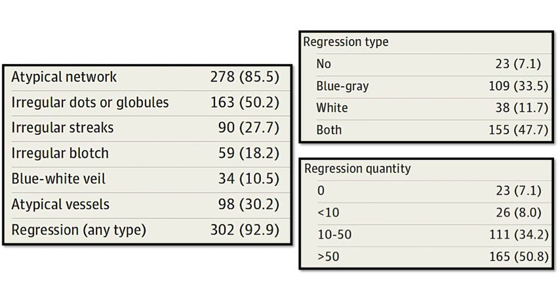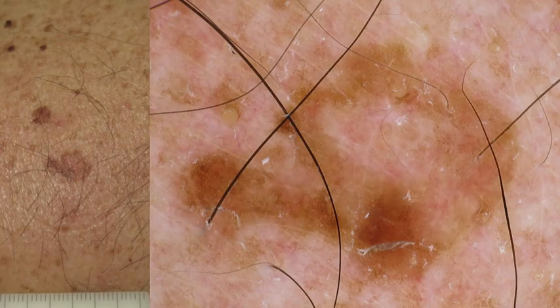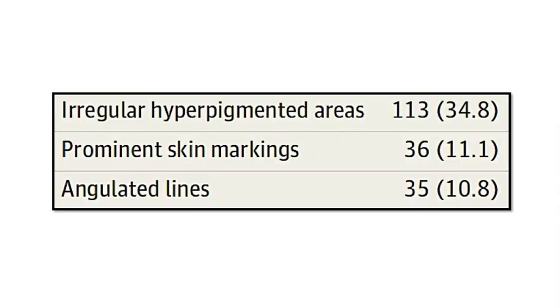Speaking about frequencies of criteria, the classic features that we knew for years were present in some melanomas in situ, but as you can see from the percentages, not in many. The most frequent classic features that we found were atypical network and regression. So this is the most common dermatoscopic aspect of melanoma in situ: a flat reticular lesion with atypical network and some areas of regression.